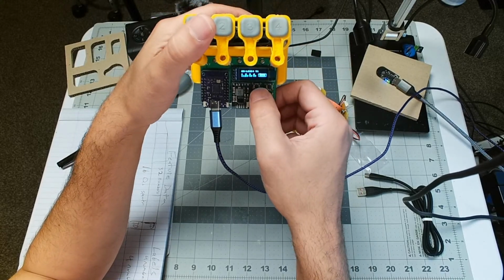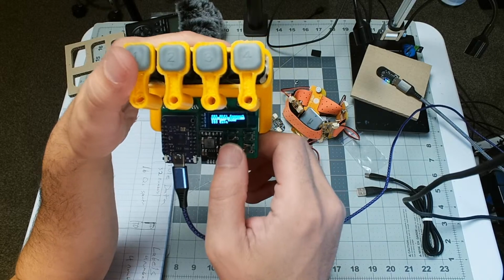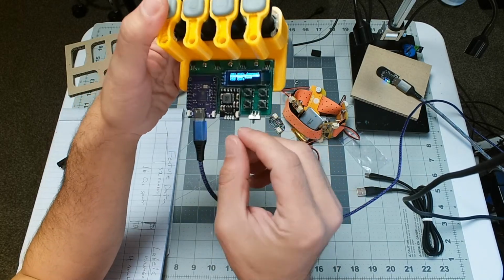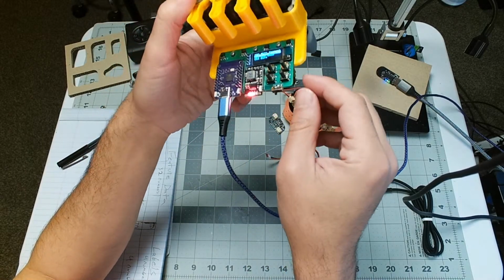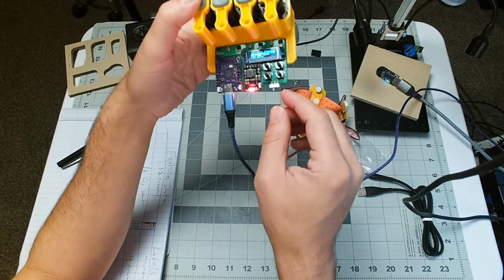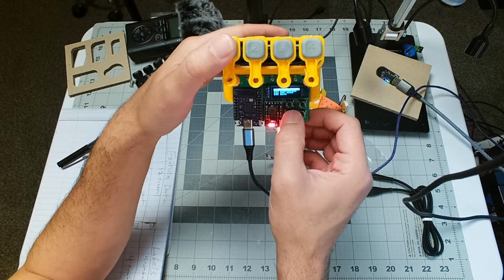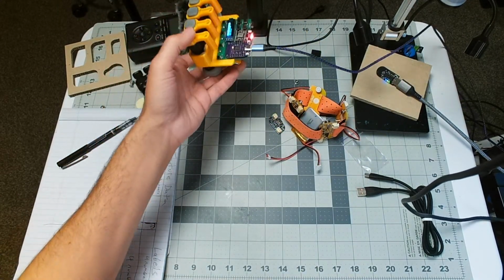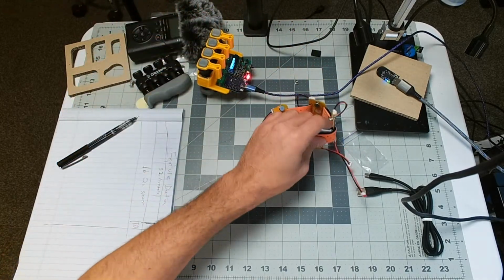So, and this is the LASK system that I have. Probably not that easy to read, but okay, good. The battery is charging, so it was at 1, but it's charging up. So I'm just going to leave this plugged in. But this is my label device. We'll set this to the side. And then when this one's done charging, I will charge this battery.